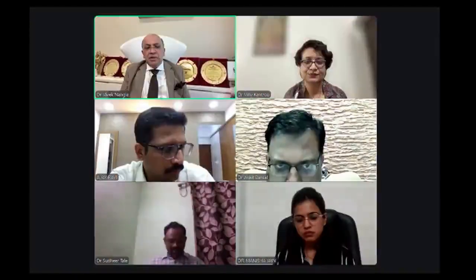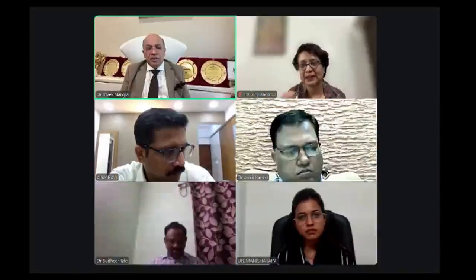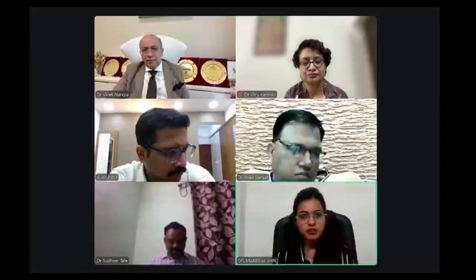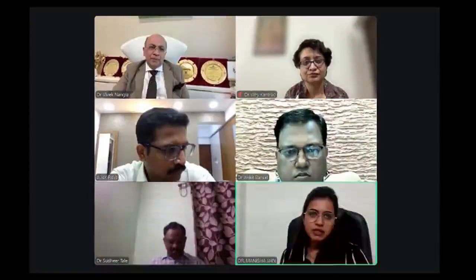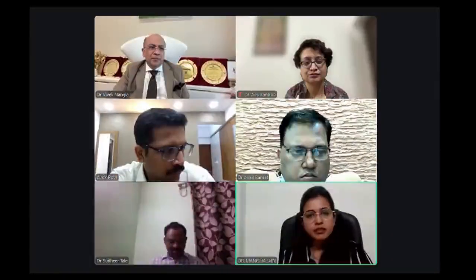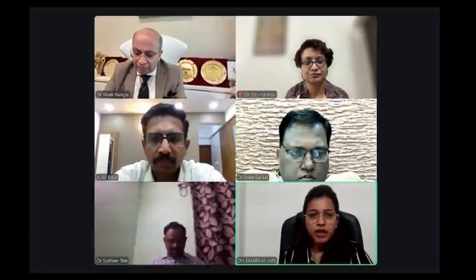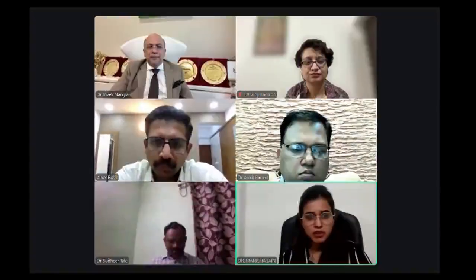Right. So, Dr. Manisha, we were also talking about anticoagulants. Can you please tell us again how you prepare your patients if the patient is on anticoagulants? Definitely, sir. In the first part, I would just be repeating what Dr. Vinny has already mentioned about the anticoagulant treatment and when to stop what. So basically, when the patients are on anticoagulant therapy, meticulous planning is required, and we should stop anticoagulants like warfarin at least 5 days prior to the procedure, and we should ensure that an INR of less than 1.5 is maintained. Apart from that, the newer oral anticoagulant agents can be stopped 2 days prior as per the guidelines.